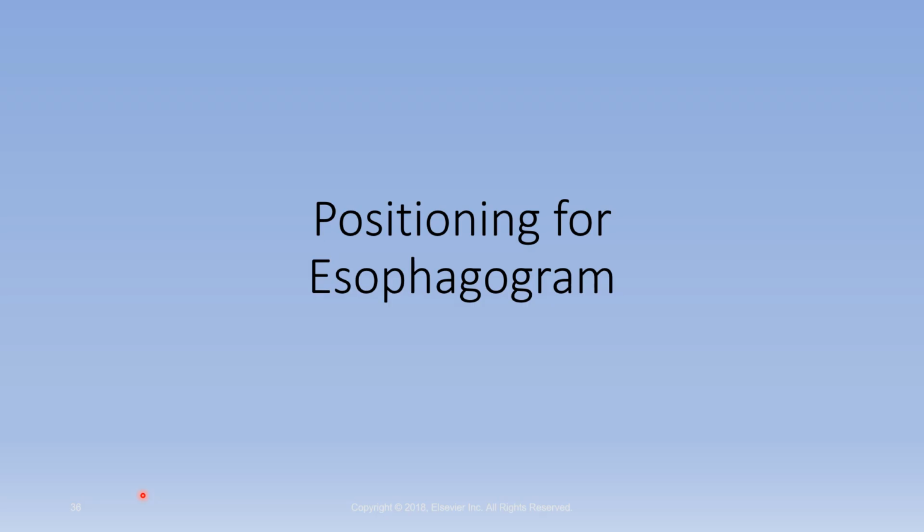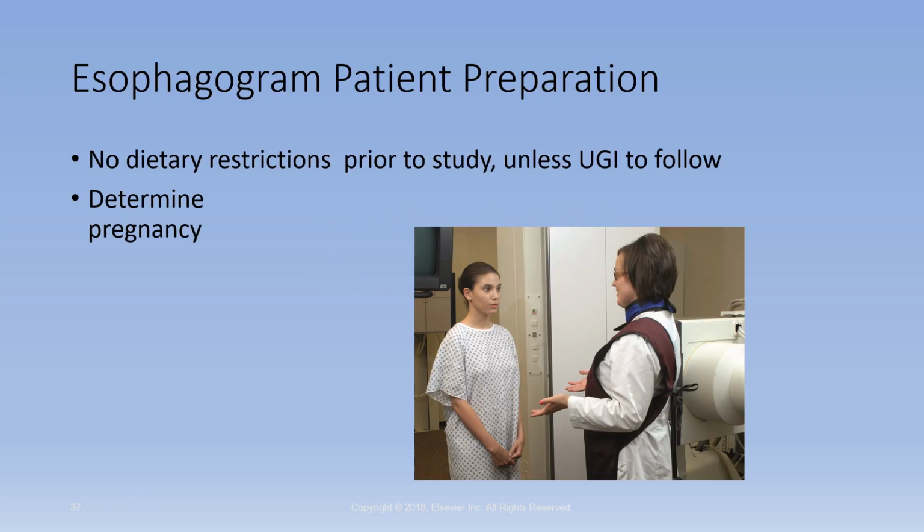And that starts on page 490. Okay, we'll talk about an esophagogram. The positioning starts on 490. The patient prep for an esophagram.